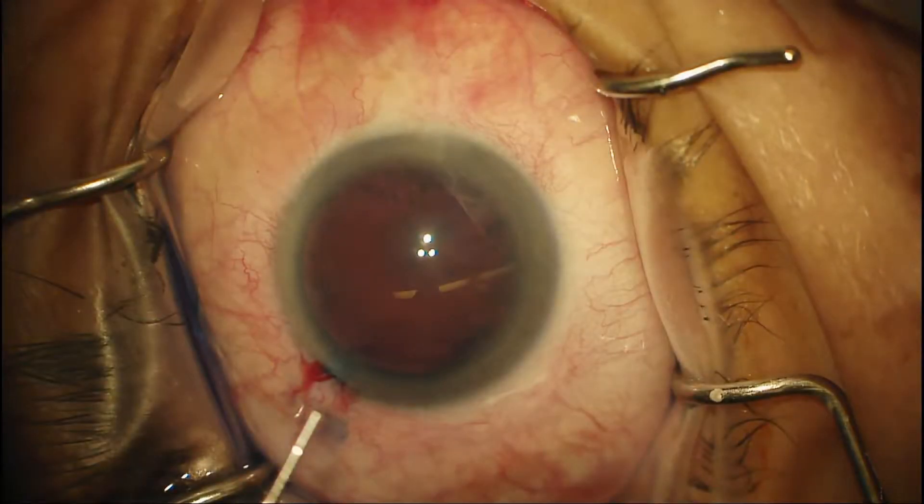Hi, my name is Dr. Lehmann and I'm going to be narrating this video of a phacoemulsification I performed in Trujillo, Peru. It's a pretty standard type cataract down there — a pretty dense nuclear cataract, probably in the 2050 to 2070 range.